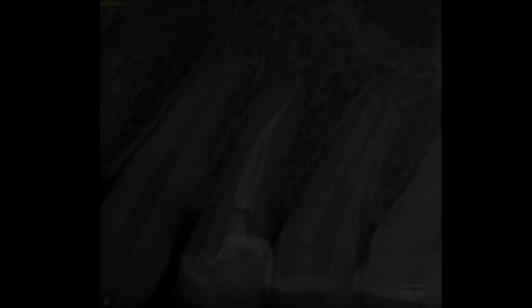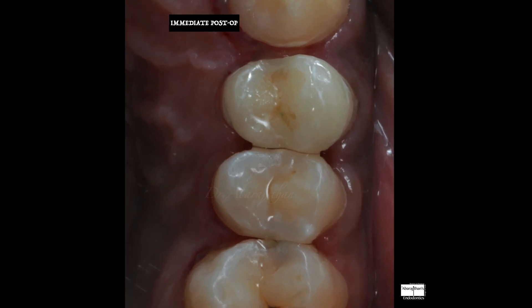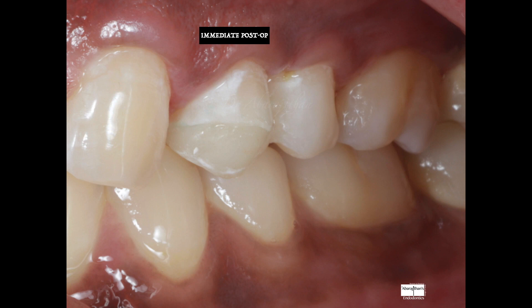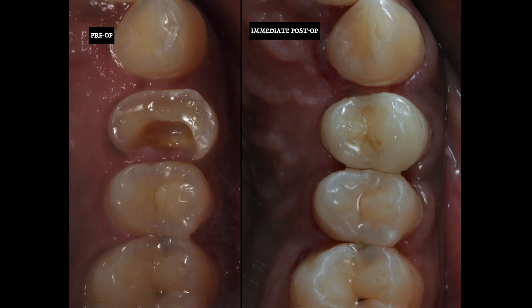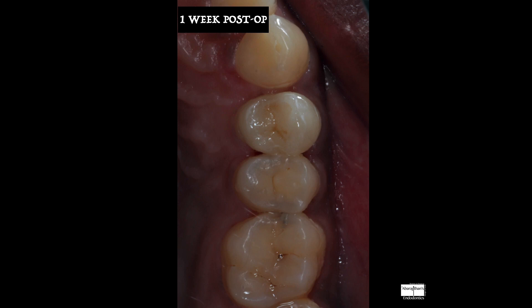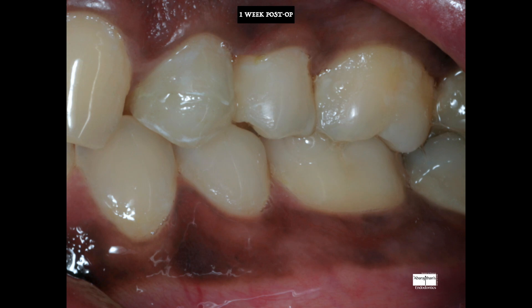This is my post-op radiograph, and this is the immediate post-op clinical picture. You can see a slight difference — it's not exactly blending with the natural tooth because of dehydration of the natural tooth after isolation with rubber dam for quite some time. This will be all right by the time the patient comes for the follow-up. This is where we started and this is where we finished. This is the one-week post-op, and you can see the health of the gingiva getting better. This is the comparison of the pre-op, the immediate post-op, and the one-week post-op — after one week you can see the shade blending very well with the natural tooth because of tooth rehydration.